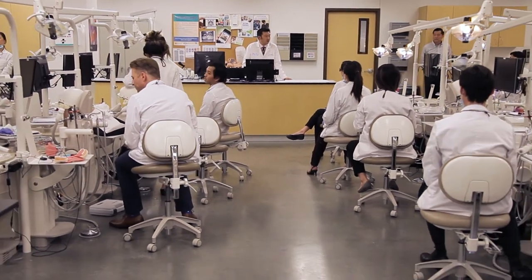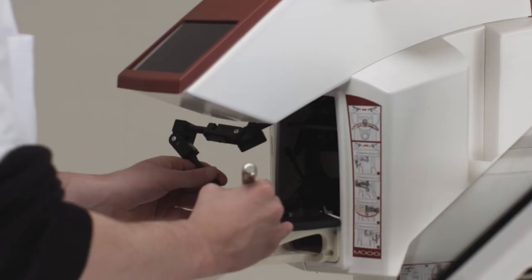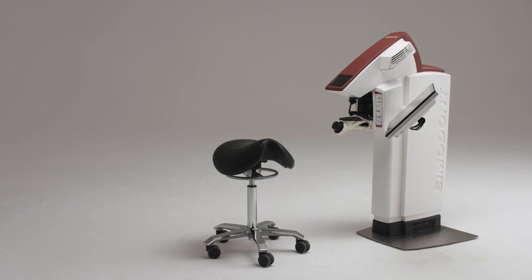Students these days are looking for this kind of technology — they live it every day, and if you don't deliver, you're missing the boat with this. This technology is helping us tremendously in moving students forward. It wasn't hard for us to decide this is something we need to have at Western U. We feel very lucky to have a partner like Moog to be able to develop the future of dentistry.